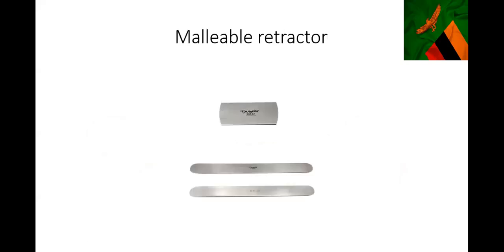This is a malleable retractor - a kind of retractor that is straight, looking like a ruler. So when you see it in your exam it will look like a ruler on the table. Some people call it a shoe. It's used when you are suturing the skin - you put it under the incision so that you don't injure organs below as you suture the skin and so on. That's a malleable retractor.